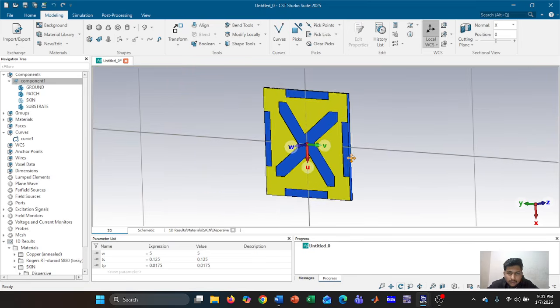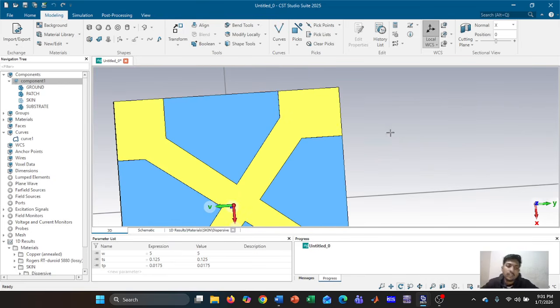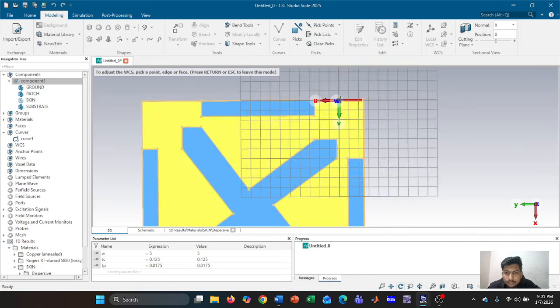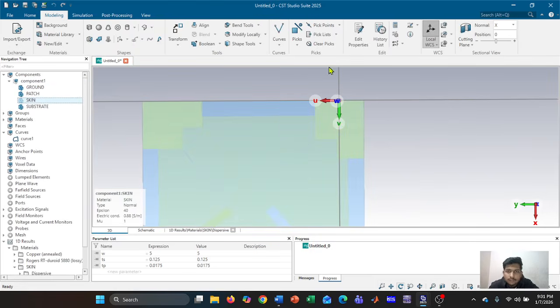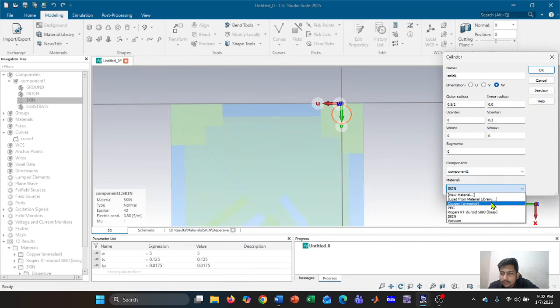So to connect this main patch to the ground patch, or you can say to short these two patches, I'll design a shorting pin. From the ground patch it will be easier to connect this. First of all, I can select the local axis on this side. For the shorting pin, I will select the cylinder. So cylindrical outer radius would be 0.5 by 2. Let's see. Okay, 0.3 in the middle. Okay, it's good. Material would be copper annealed.